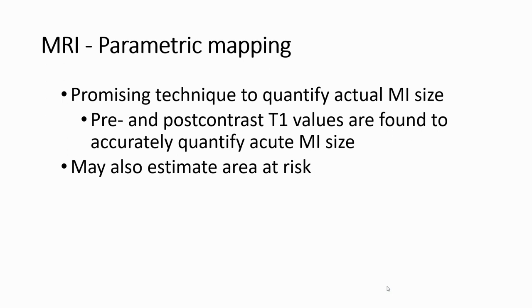Parametric mapping is a promising technique to quantify acute MI size. Pre and post contrast T1 values are found to accurately quantify acute MI size. It may also estimate the area at risk.